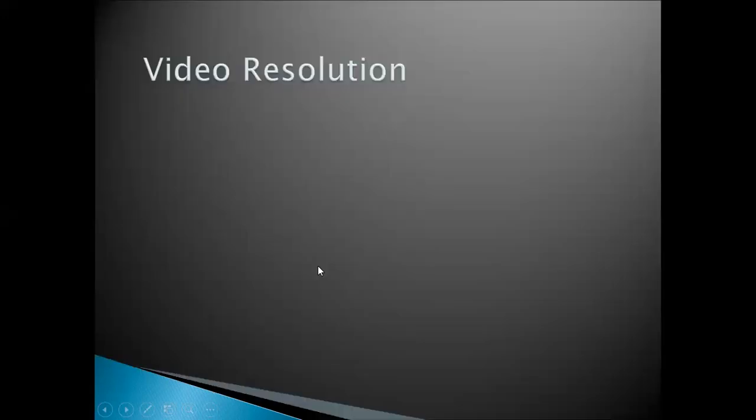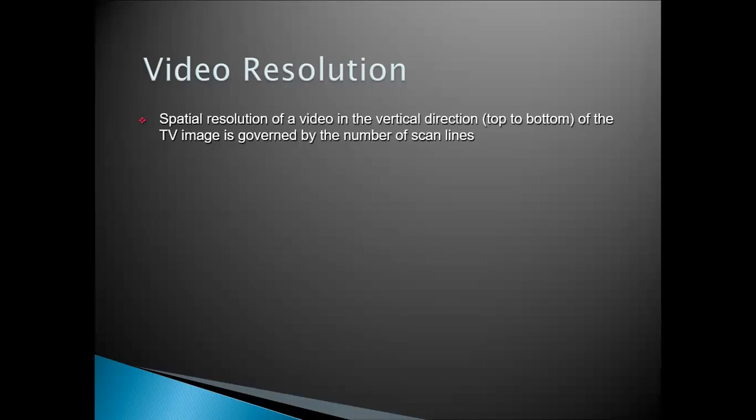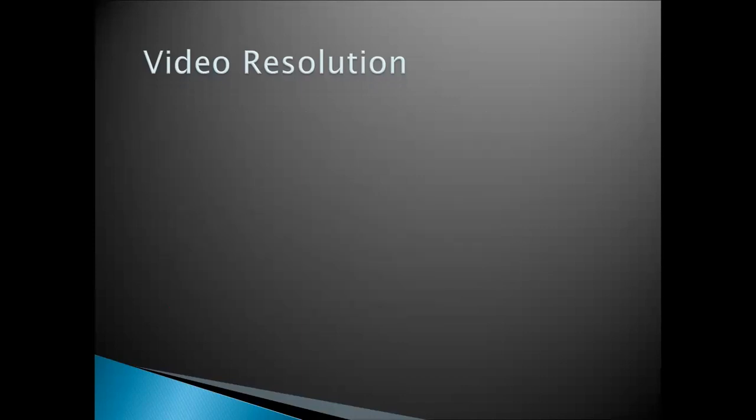That is what constitutes lag. We want to avoid lag as much as possible, but it can be of benefit in some procedures, basically in DSA, digital subtraction angiography. I think we might have to see that later.